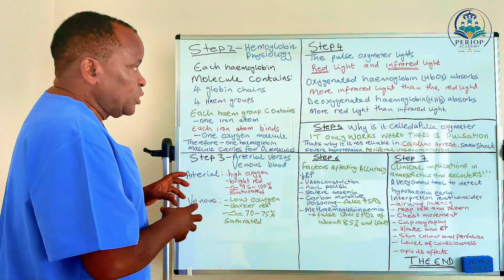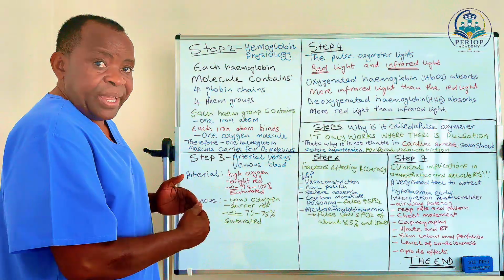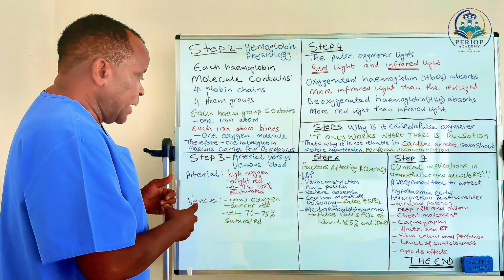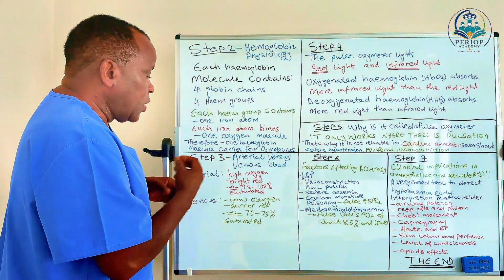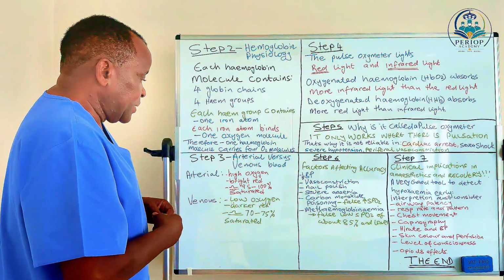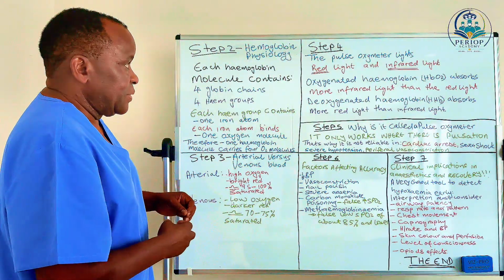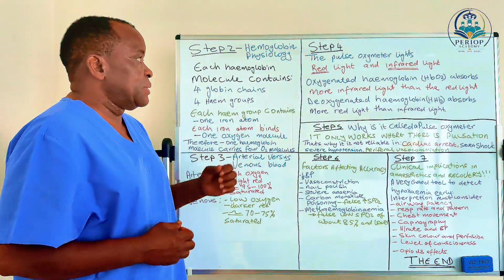This is what we want to now see how it works. The behavior of these red blood cells, oxygenated and deoxygenated red blood cells, in relation to pulse oximetry.